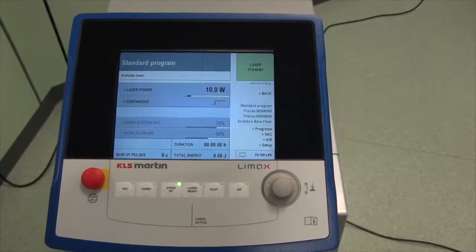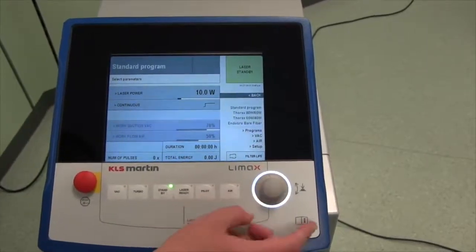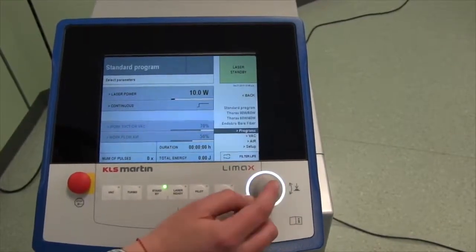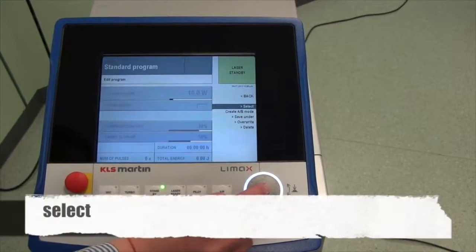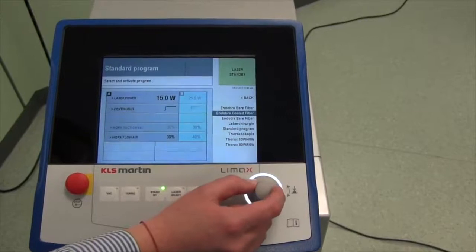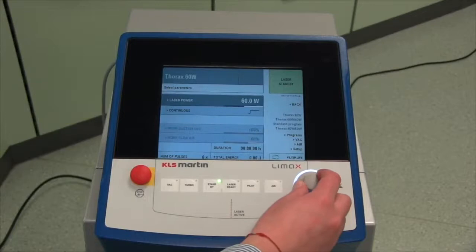Let's turn to the display and the programs. Press the rotary knob in order to get to the main system menu. Turn it to get to the submenu Programs. Press Select. Now you can see the programs already saved and you can choose one. In order to change the parameters, press the rotary knob.